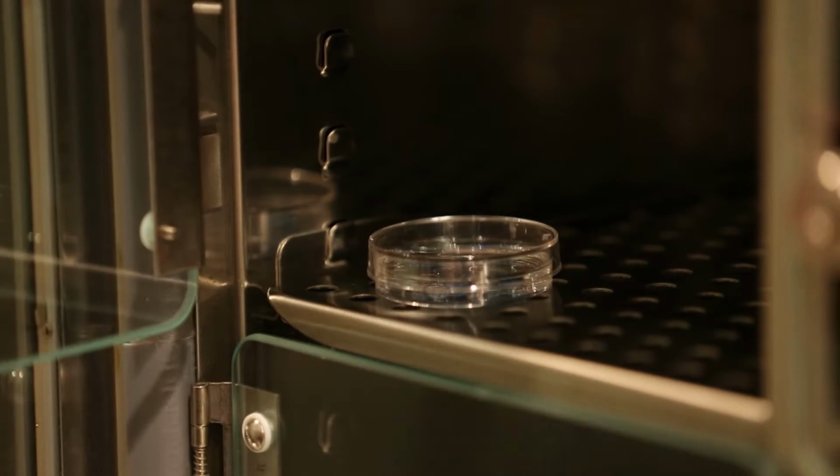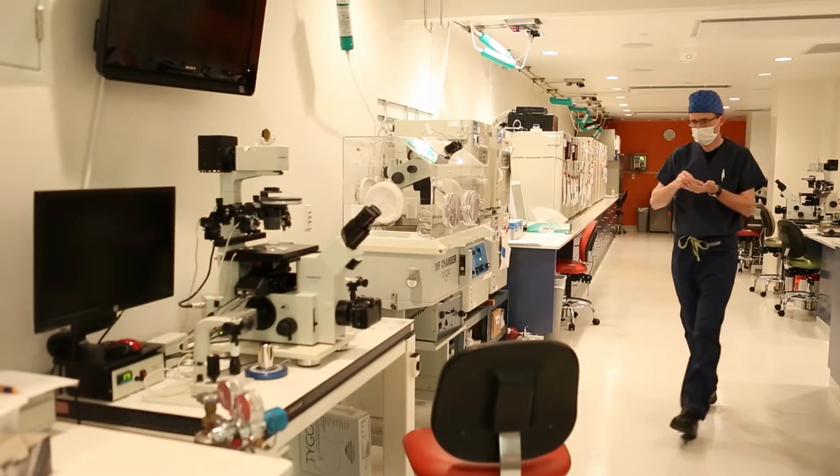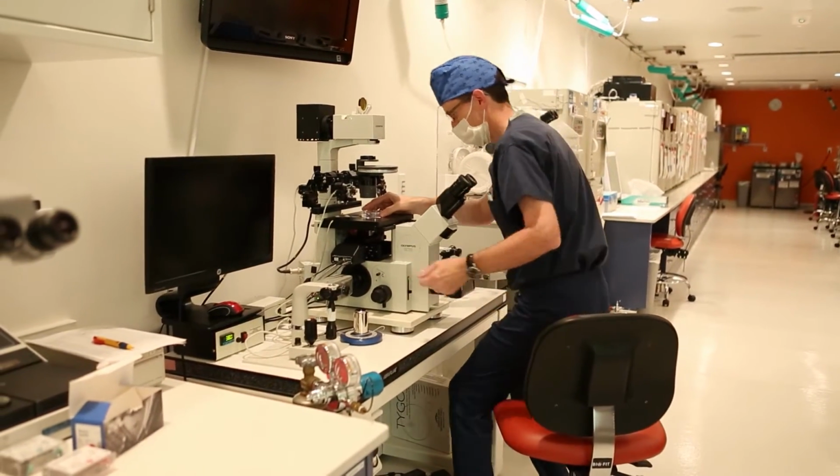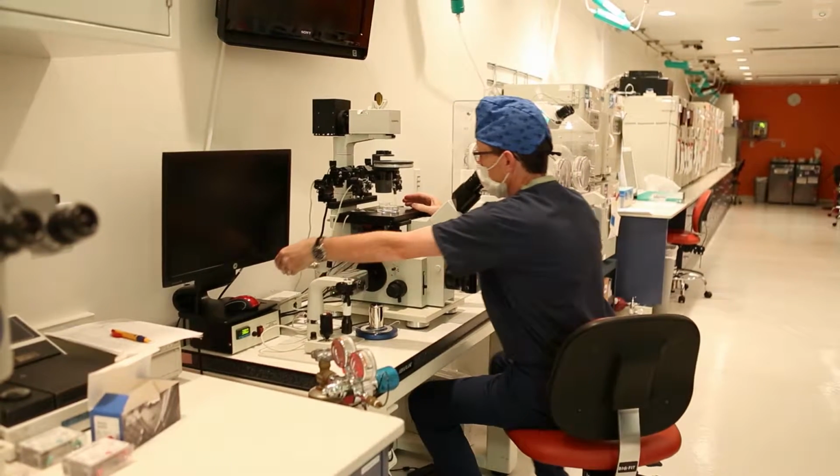We remove the petri dish containing the embryos from inside the special incubator that replicates conditions inside the human body. In order to observe the embryos, we take the petri dish to the microscope stage and examine each embryo carefully. In assessing the day 5 embryo, we first look to see what stage the embryo has reached.